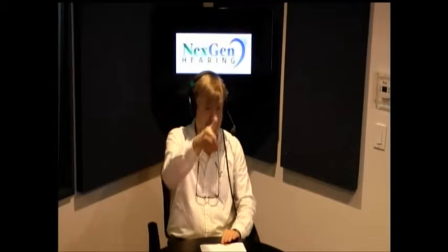Sure. The pitches run from left to right across the page. So from low C to middle C to high C, and then octaves going higher. That runs across from left to right. And then decibels run from 0 down to 120, which is screaming loud. So we test how many decibels is required for the right ear to hear all the different pitches. We mark down those scores as O's across the audiogram. And then we do the same for the left ear, and we mark down the scores for the left ear as X's. So, like I say, we play tic-tac-toe.